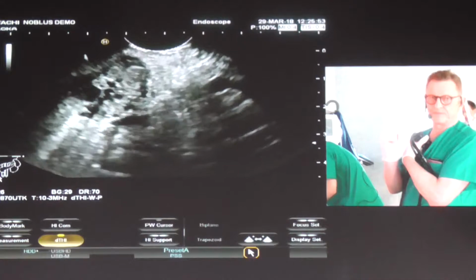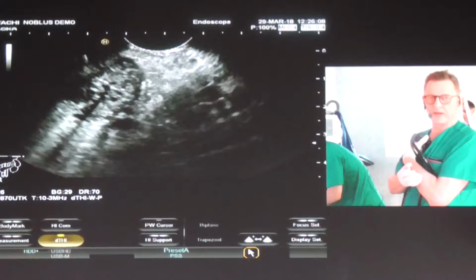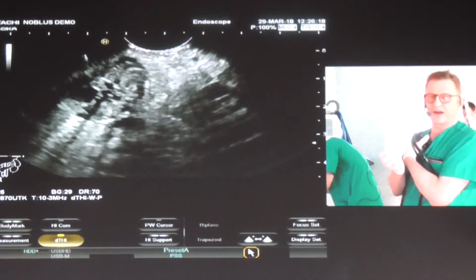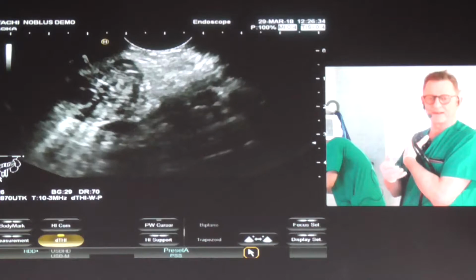So therefore, from FNA, we always now in our PhD project always do microbiopsy forceps from these kinds of occasions. And confocal microscopy. Yes, and we are actually able to subclassify mucinous cysts based on immunohistochemistry. And we also do molecular analysis, next generation sequencing in these cases, because we need better examinations to finally decide for these patients.